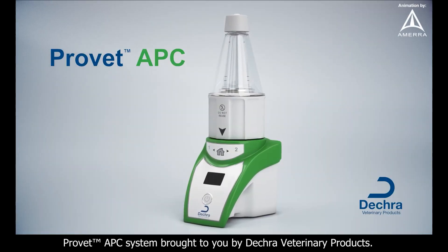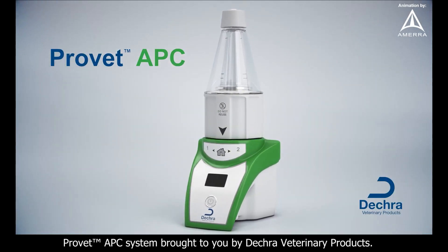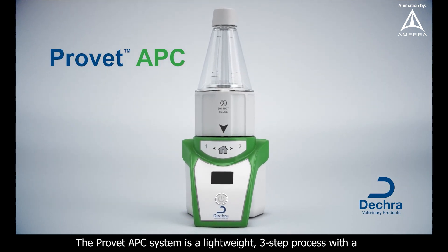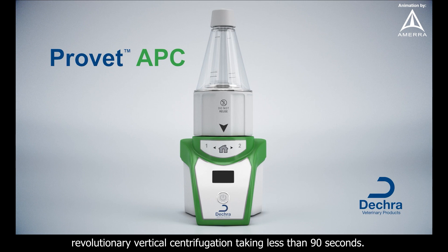ProVet APC System, brought to you by Decra Veterinary Products. The ProVet APC System is a lightweight, three-step process with a revolutionary vertical centrifugation taking less than 90 seconds.